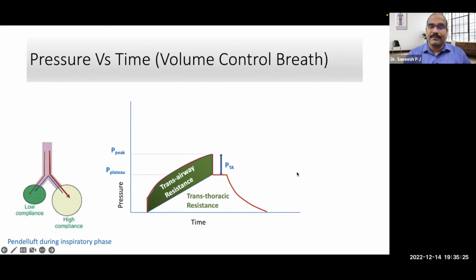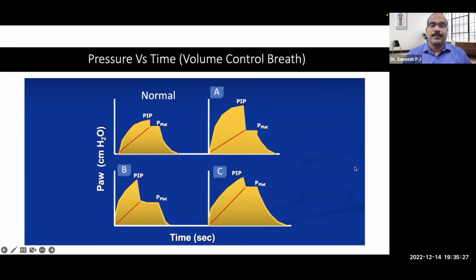Similarly, we'll come to that graphic later. Yes, this is the graphic. Anoop, if you want to chip in, you can join.